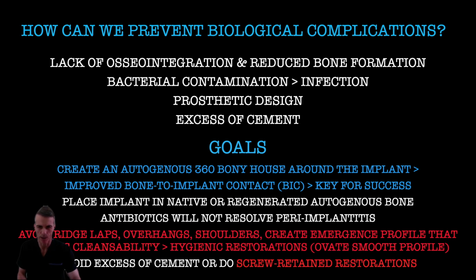By all means, avoid the excess of cement. I definitely am a strong advocate of screw-retained restorations. Whenever possible, a screw-retained restoration is the best.